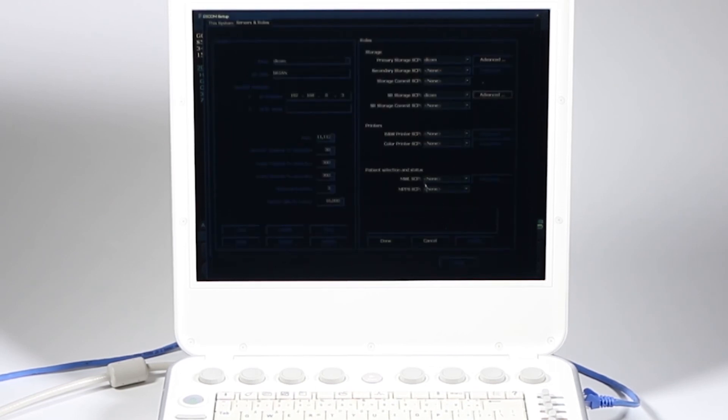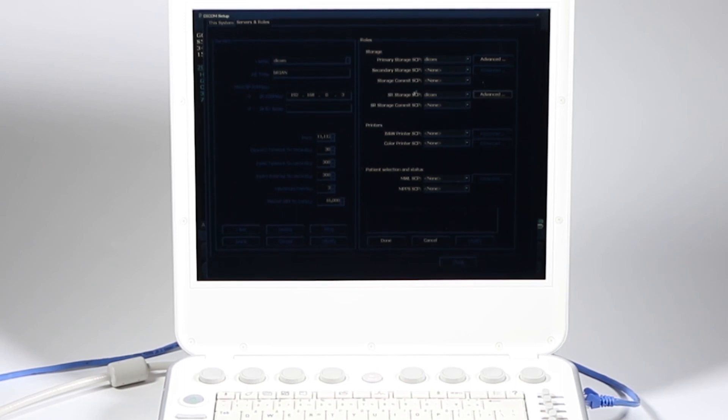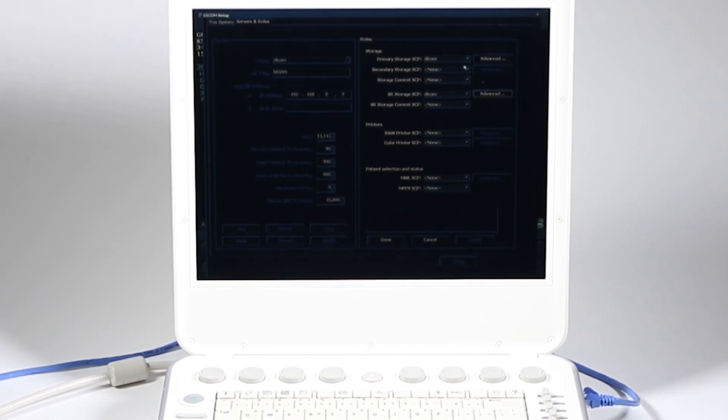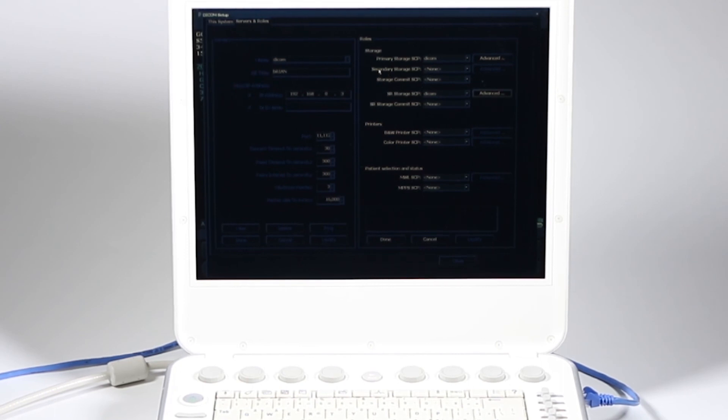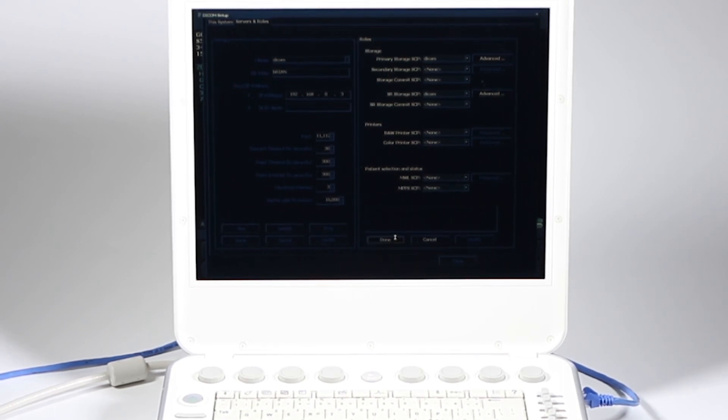I'm not using any printers, modality work list, MPPS, storage commit. Secondary storage up here will take you if you want to send images to two different locations. So I'm done. And I can go ahead there.